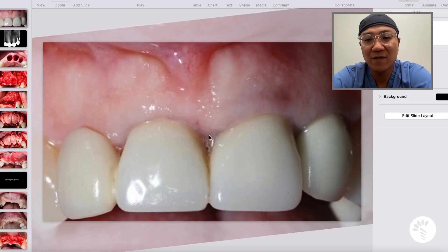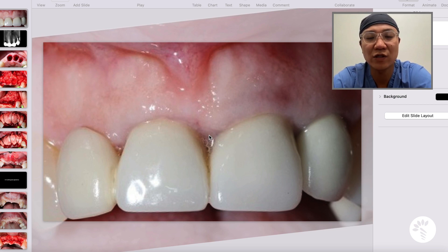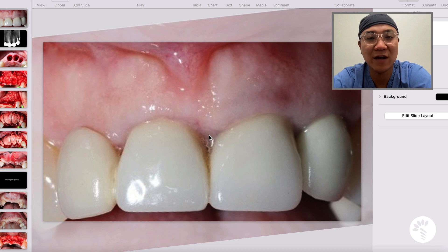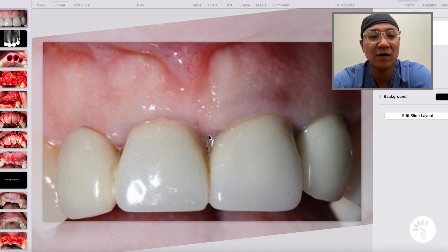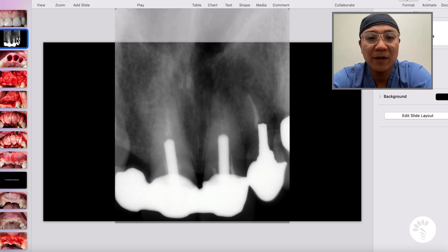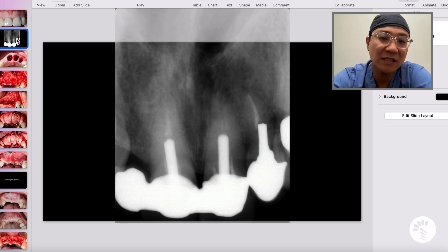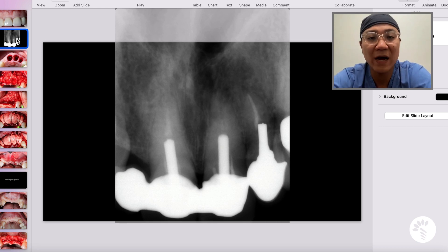I would like to review a case of Joanie today. She presented to my office with failing endodontic treatment on the maxillary left central incisor and lateral incisor, which are part of a four-unit bridge from the maxillary right lateral incisor to the maxillary left lateral incisor. The maxillary right lateral incisor is a cantilever restoration, and she had trauma in the past which ultimately led to failure of the endodontic therapy. On the periapical radiographs, you can clearly see there is a large periapical lesion on the left lateral incisor, and you do not really see too much of any lesion on the right central incisor.